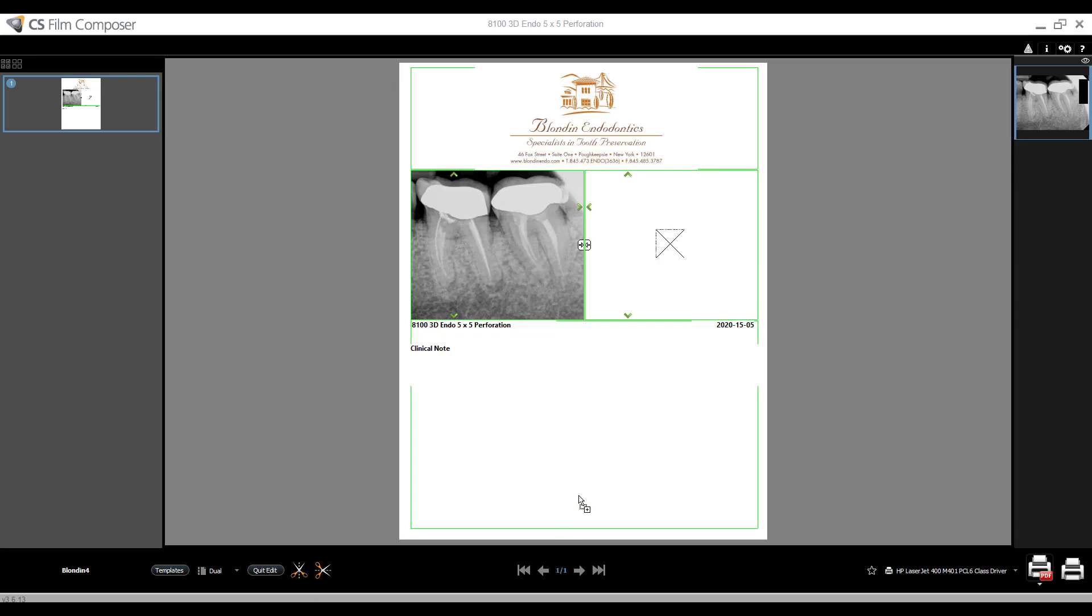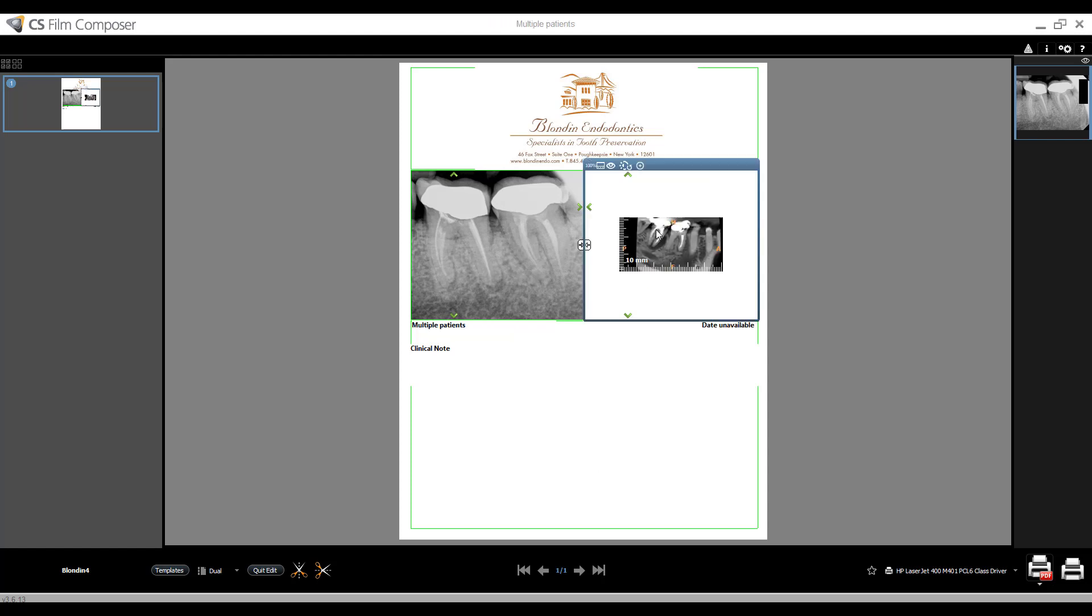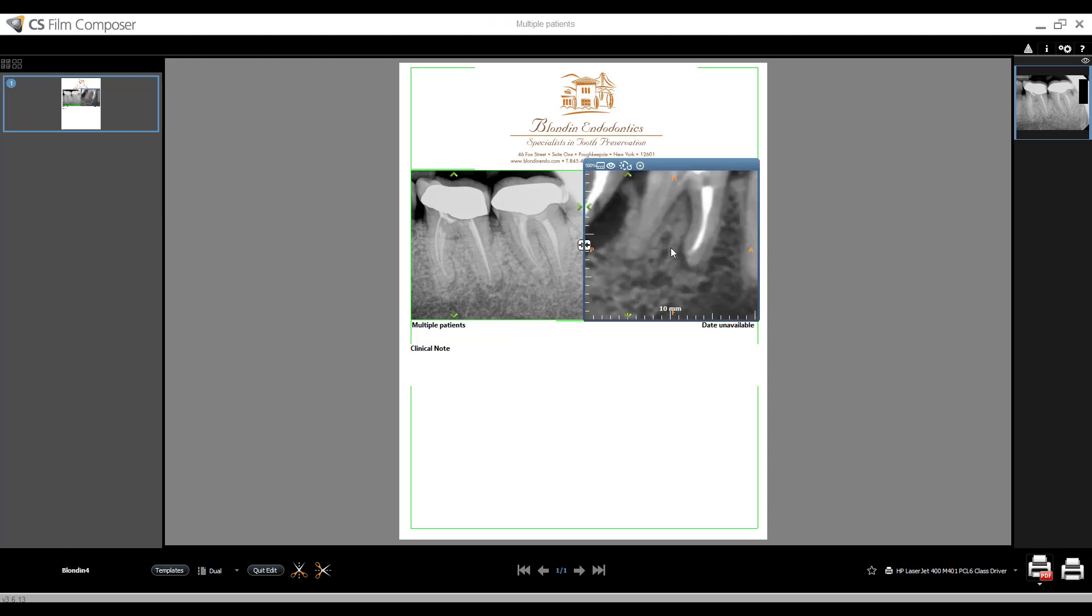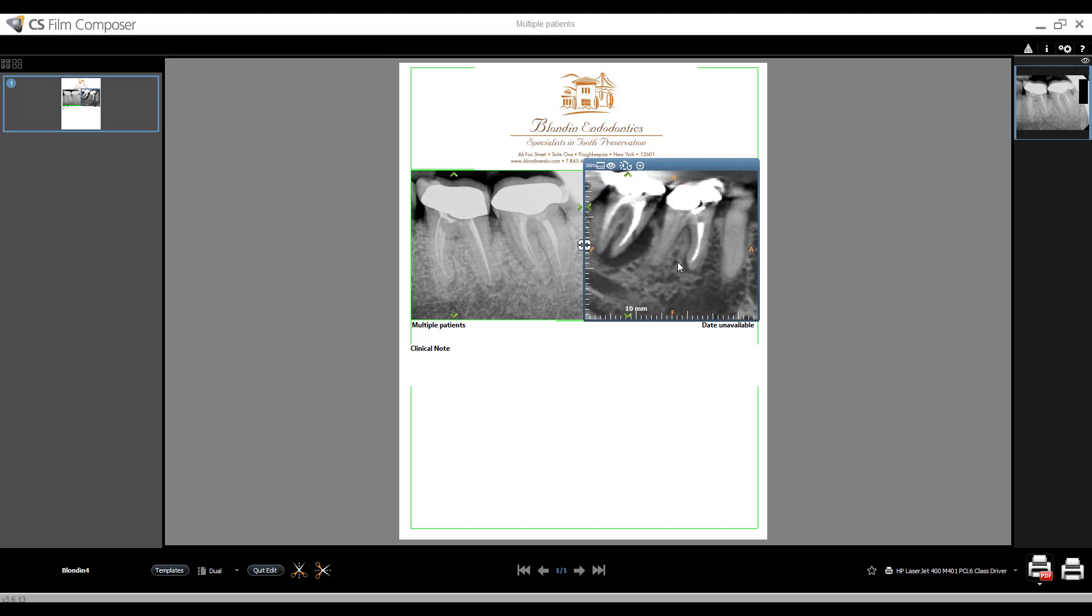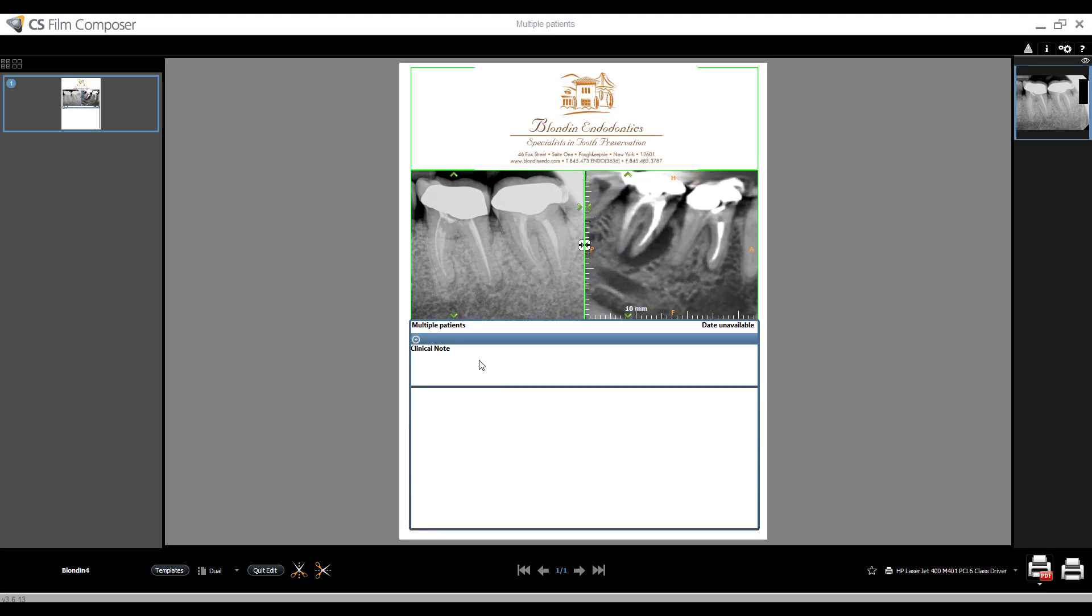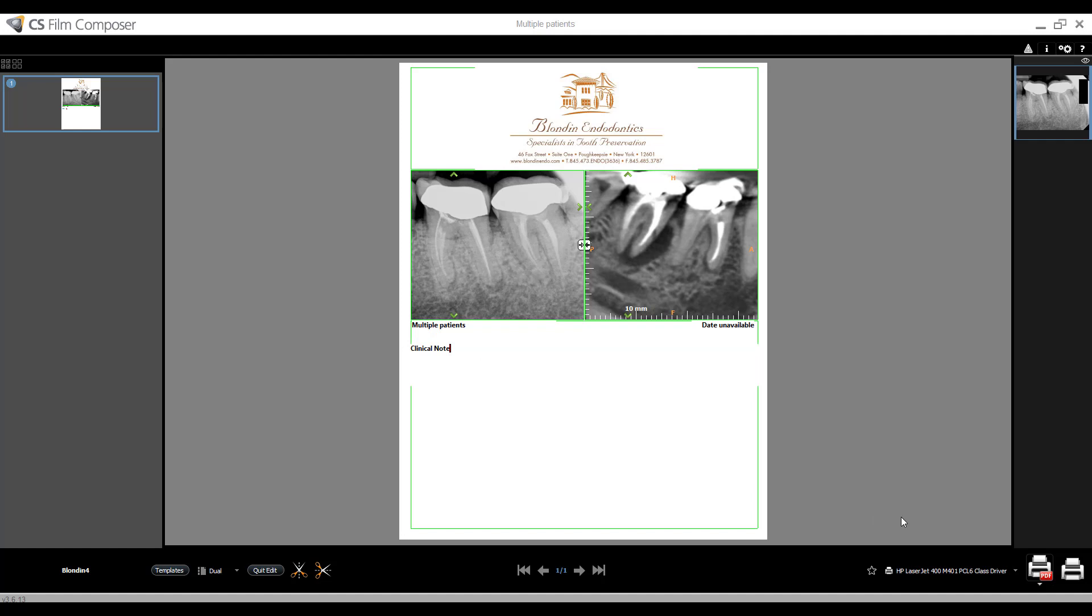My left mouse button is still being held. And I'm going to let go on top of this. So now I can take my zoom, zoom in to however I want, add my clinical note, and I'm off and running.